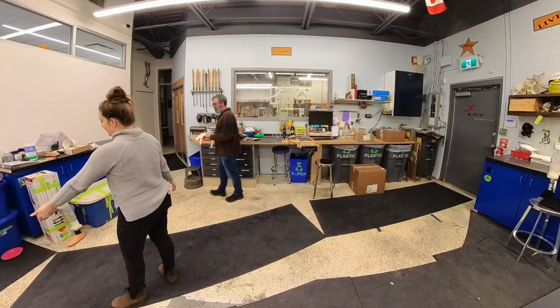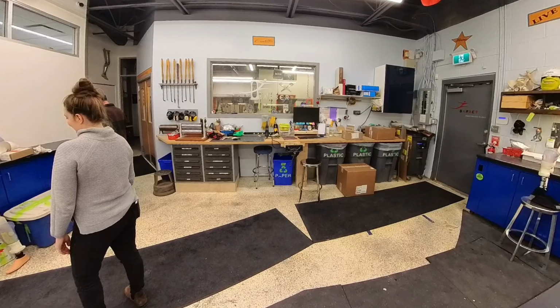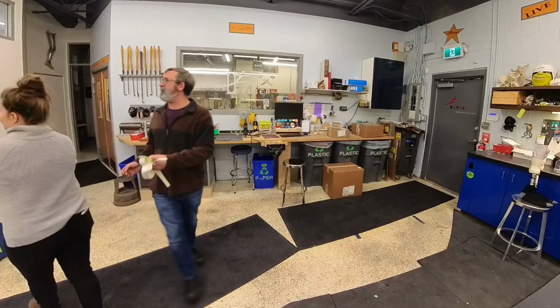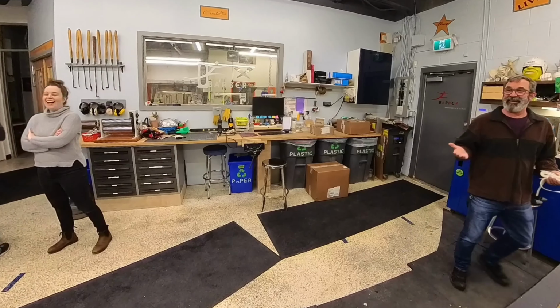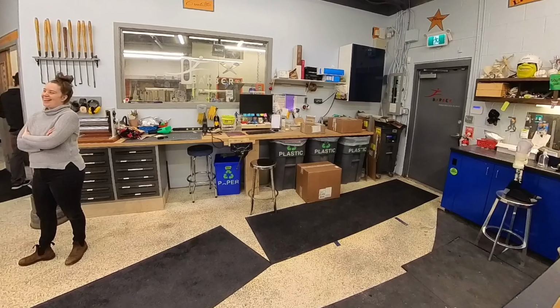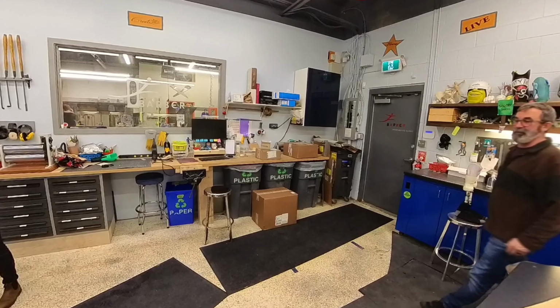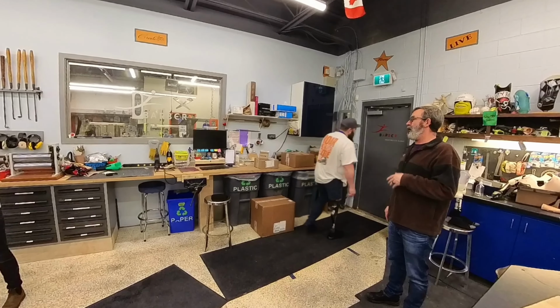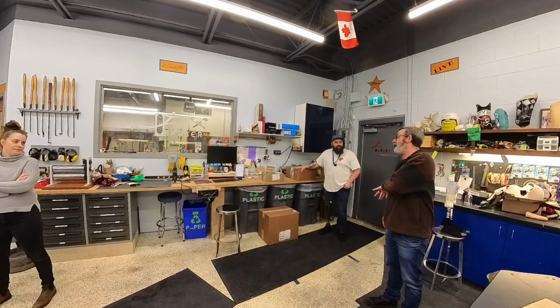Shoes too. I bought new shoes because I thought Leah doesn't want to see me come in muddy shoes again. Yeah, these are awesome. You know what we tell our patients? You never build a house on a crappy foundation. So we're fitting you with a leg. That's the same thing we say with tires on cars. You don't start on cheap, crappy tires on a car. That's the biggest problem that we have when we're trying to fit legs: they come in with crappy shoes. Or the worst is when they're brand new amputees and they bring in their shoes that they're beat up with their real foot.